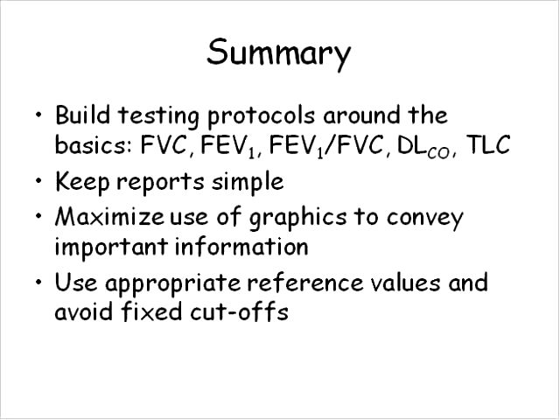Another question is, when is it recommended that we perform a slow vital capacity if it is always done after the FVC and obstruction is present? Well, it's a good idea to do a slow vital capacity, and the ATS-ERS guidelines for lung volume measurements recommend that we do what they refer to as a linked vital capacity. That means that while we're measuring the patient's FRC, whether we do that in the body box or using a gas dilution technique, while they have the mouthpiece in their mouth, either before we do the maneuver or immediately following the maneuver, we should probably do a slow vital capacity maneuver, either by having the patient exhale to residual volume and then fill their lungs, or just the opposite, fill their lungs and then empty that. The idea being that slow vital capacity then should give us some idea of what the lung volume compartments look like at the time that we're measuring FRC.